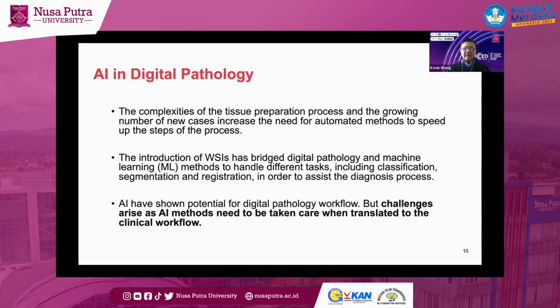In the past 5 to 6 years, AI has been used as a tool to help in digital pathology. From the last few slides, I have more or less explained the complexity of how the tissues are prepared. I'm pretty sure that today there are a lot of diseases and cancers that are evolving, so the number of new cases is ever increasing.